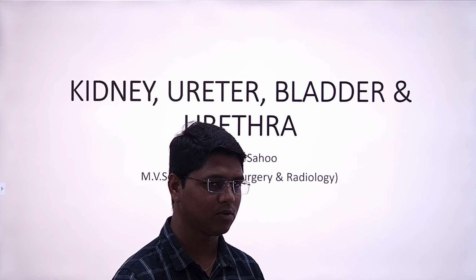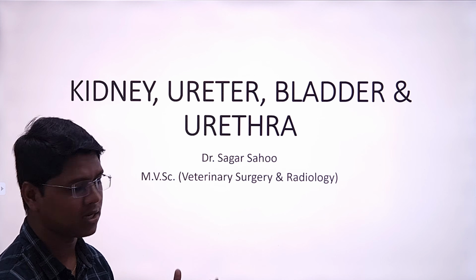Before this lecture there have been 3 lectures on radiography. First one is the normal abdomen, second is the normal thorax, and third is the radiographic pathology of peritoneum, liver and spleen. If you haven't watched those videos, please do watch them before watching this one, so that you will know how these things are taught.